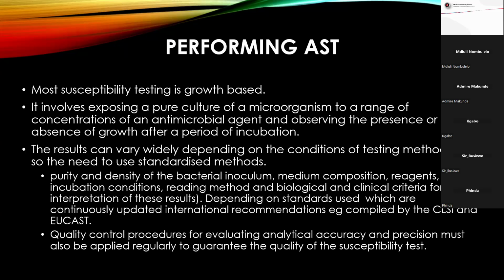In bacteriology, there's usually less talk on controls. But I want to emphasize that quality control procedures are very critical in microbiology. It has to be done routinely to check on the antibiotics which are used for testing, to see whether they are still performing well. There are a lot of factors which can interfere with antibiotics, from storage, expiry, and also different batch numbers. So these controls need to be run.